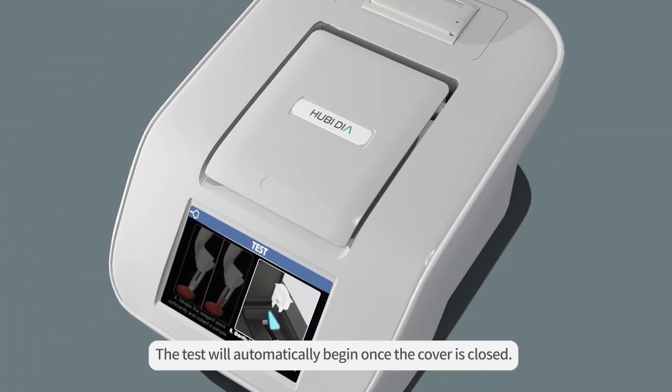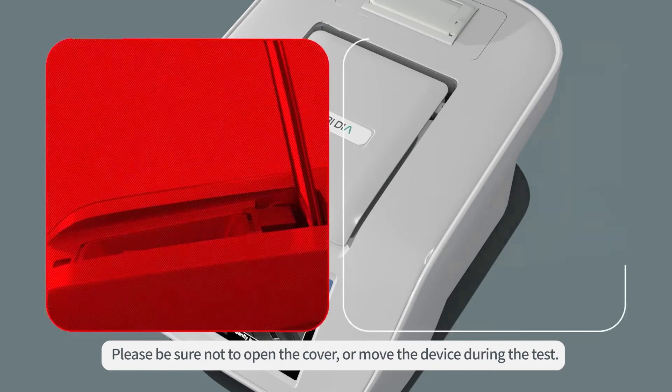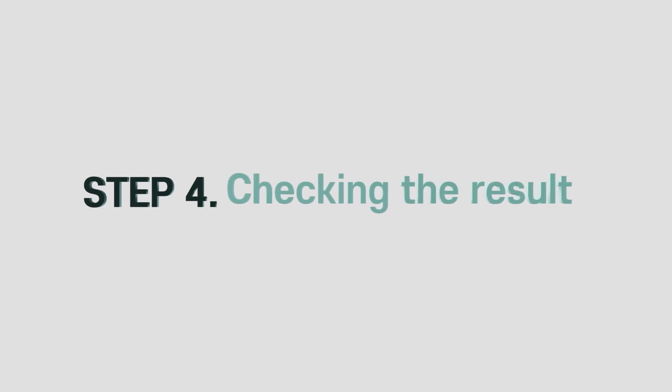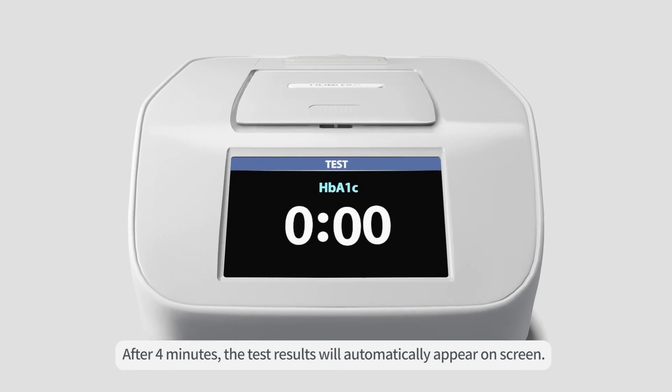The test will automatically begin once the cover is closed. Please be sure not to open the cover or move the device during the test. Step 4. Checking the result. After 4 minutes, the test results will automatically appear on screen.